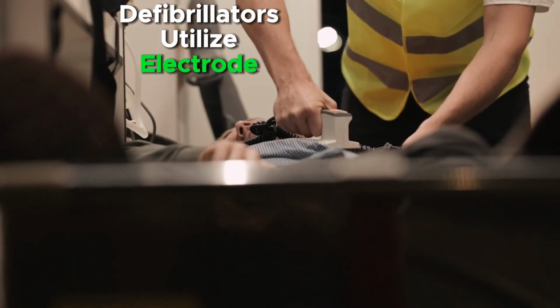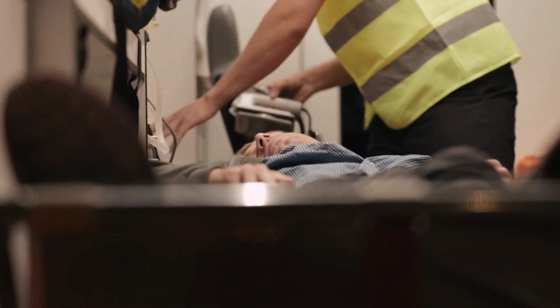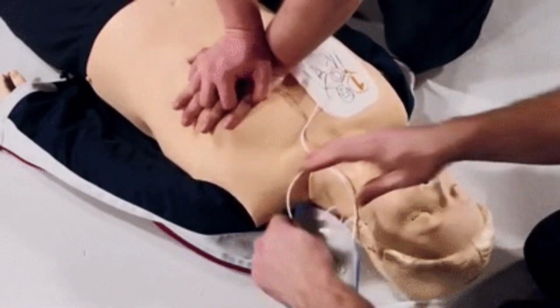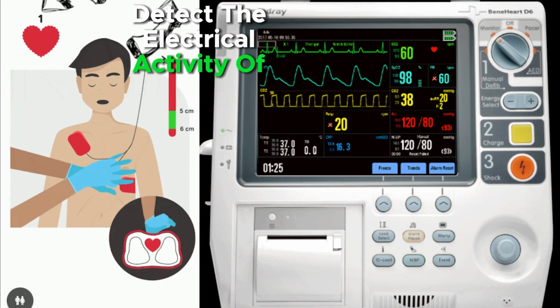Defibrillators utilize electrode pads that are placed on the patient's chest. The placement is crucial and typically involves one pad on the upper right chest and another on the lower left side. These electrodes detect the electrical activity of the heart.